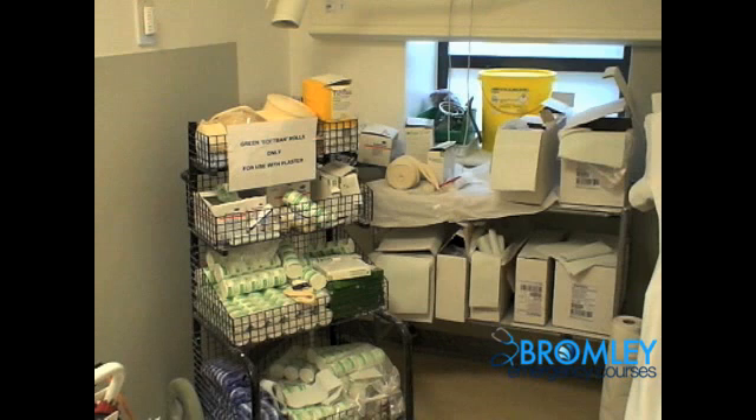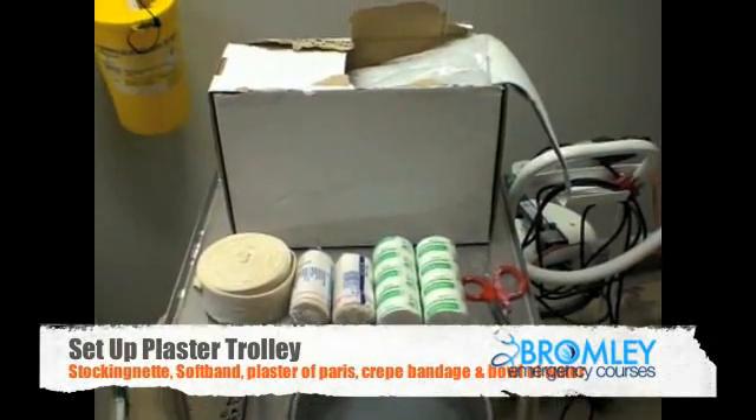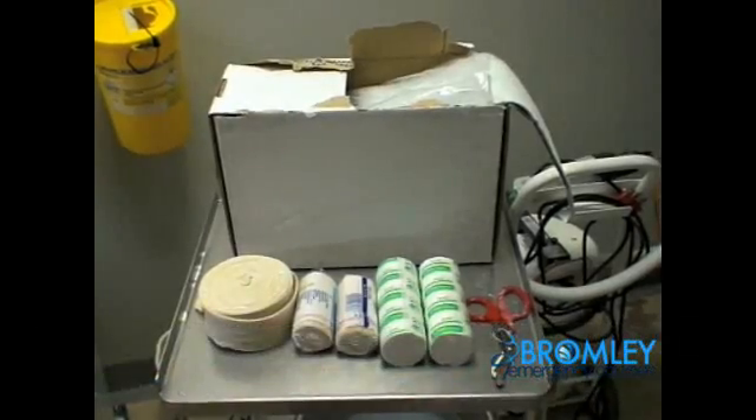As with all procedures, introduction, explanation of the procedure, and consent for the procedure is essential. In most OSCE stations, a radiograph of the injury will be provided and it is important to confirm the injury and also the side of the injury. Putting a back slab on the wrong side can only look bad. Take some time to familiarise yourself with the equipment shown, as you will need to use all of this in applying a back slab.